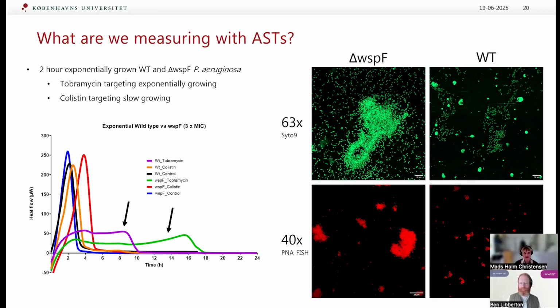And often I found that those false peaks would reach the 10% cutoff. So I thought better to be more conservative with the cutoff, to be sure that if I say an isolate is not susceptible, that it is actually not susceptible. So it's mostly out of caution, and of course it can change as I learn. But for now, that's what I've gone with.